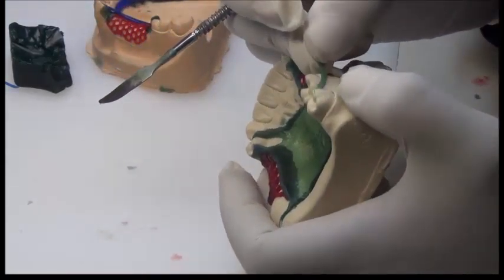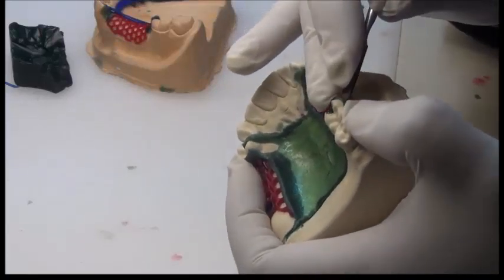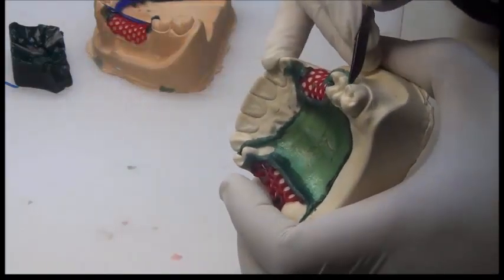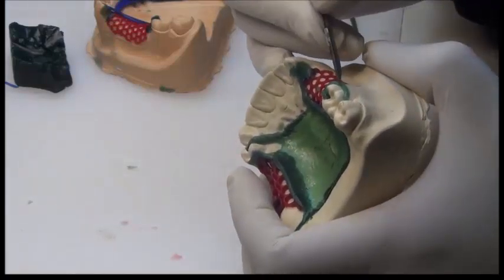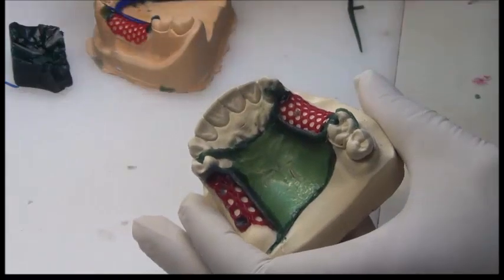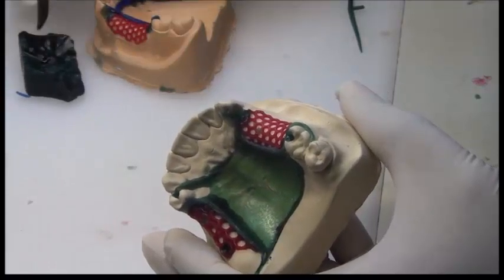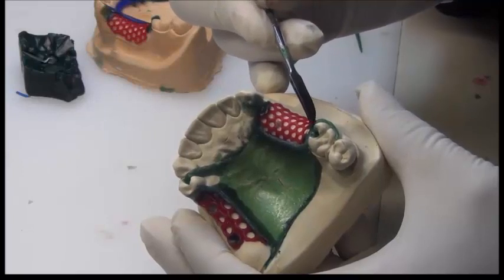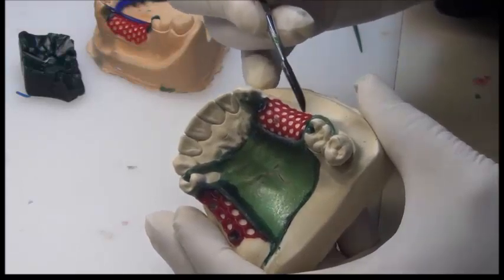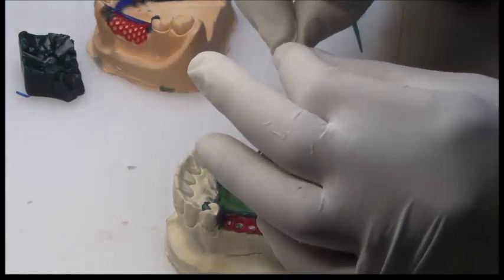Here, this is the molar. We have to adapt it well. So the retentive arm will just rest above or on the ledge that is created on the refractory cast. Don't press that much, so not to lose the shape of the clasp. Now we cut the excess here. We can seal it using the inlay wax, so to keep the clasp in its place. This way. So this is the arm, the retentive arm, which is just originated from this minor connector, which is the proximal plate here.